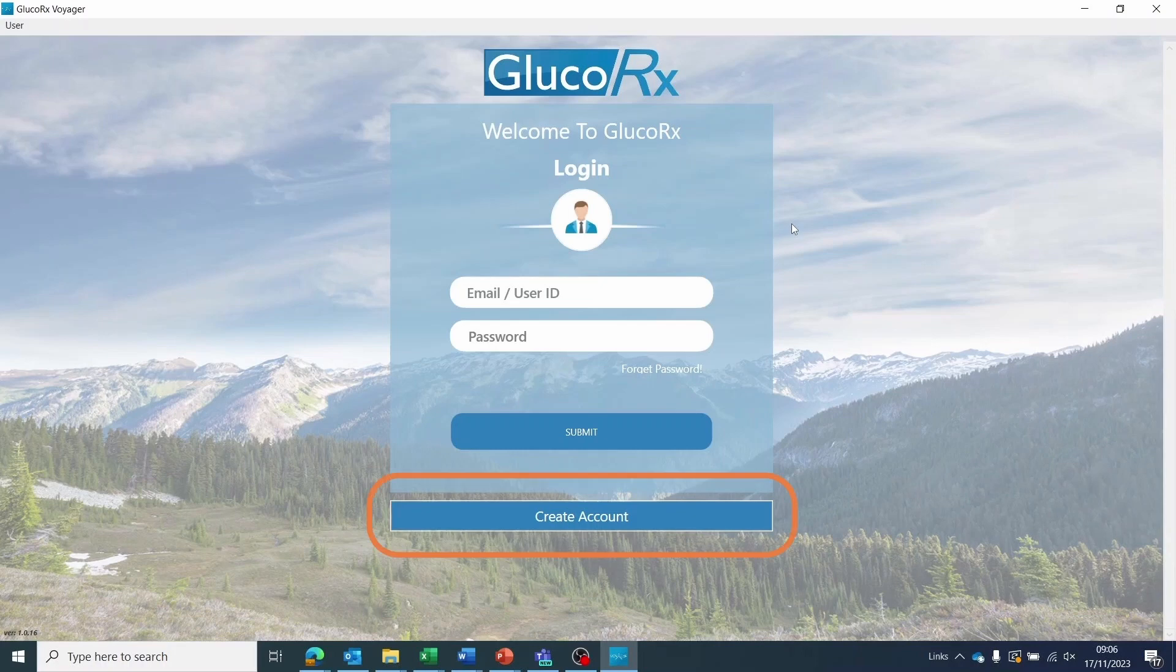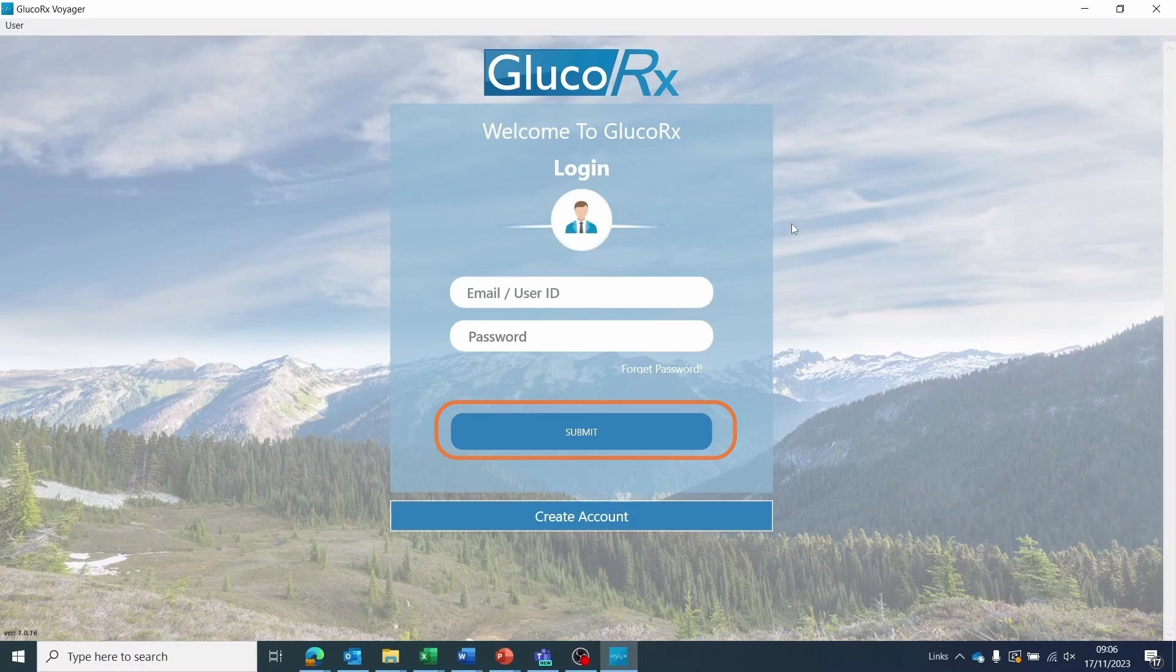Here you can either create a new account if this is your first time using Voyager or you can sign in using the same account details you registered on the mobile app. Once you have entered your details, click submit.